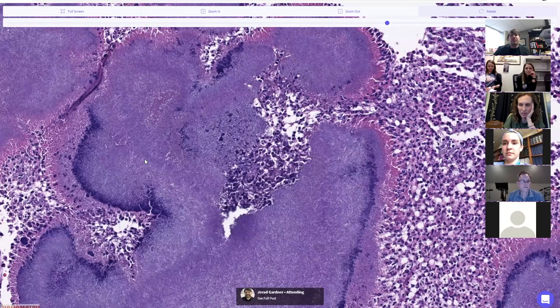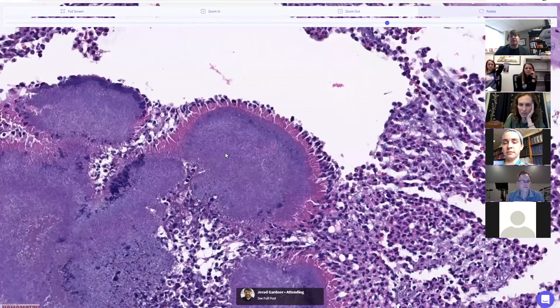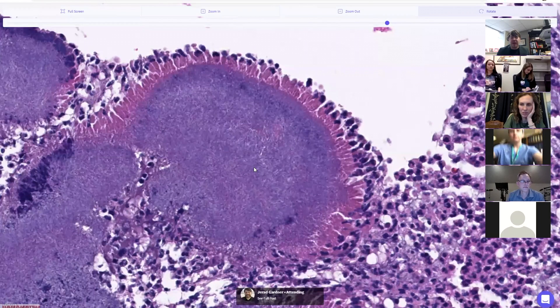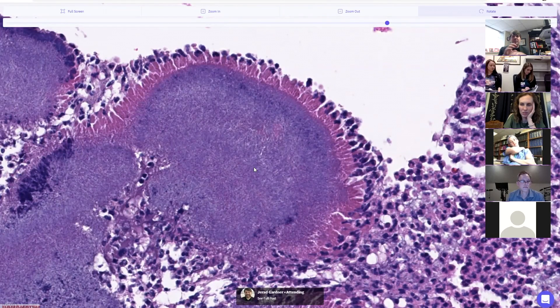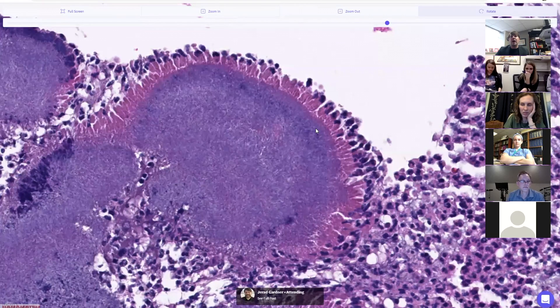There's a third thing that can look a little like this but is usually not nearly as big or dramatic, and that's botryomycosis. Botryomycosis is not a mycosis at all — it's actually a bacterial infection, most commonly cocci like strep or staph. A small collection grows down in the dermis, forms a little ball colony, and gets wrapped in Splendore-Hoeppli phenomenon. When you see cocci in the middle, you can say this is probably botryomycosis, a bacterial infection.